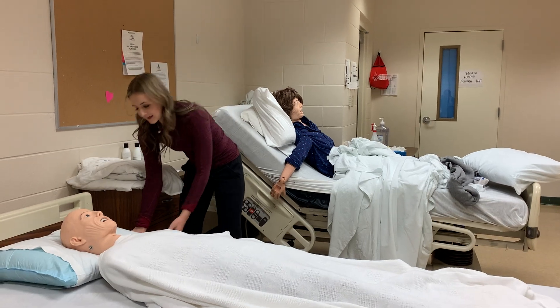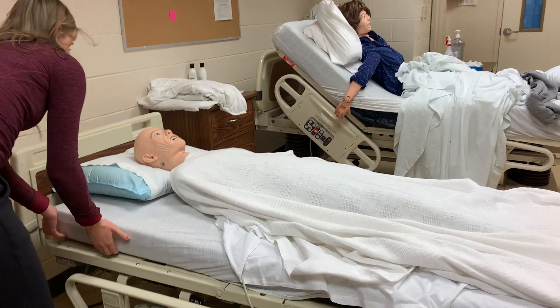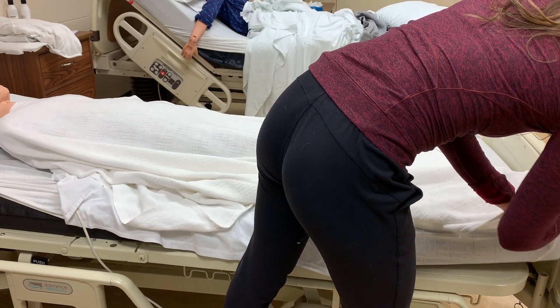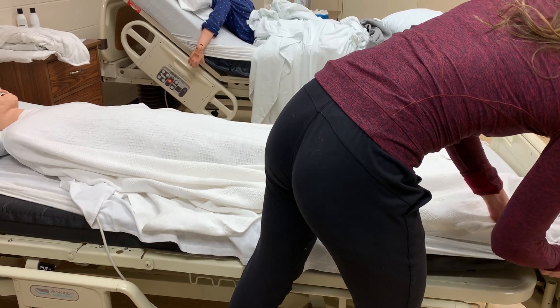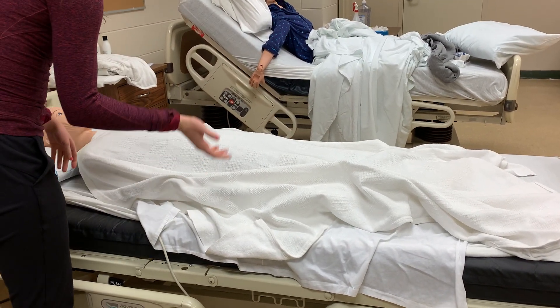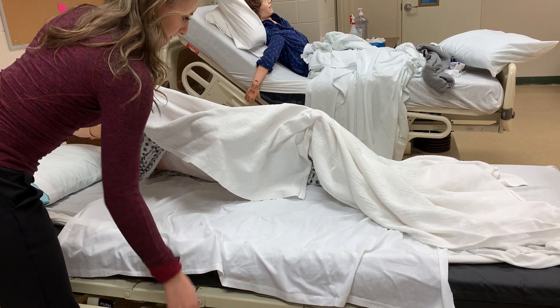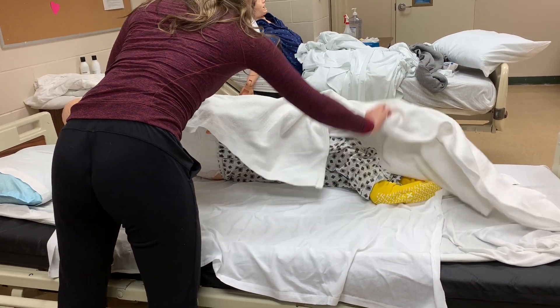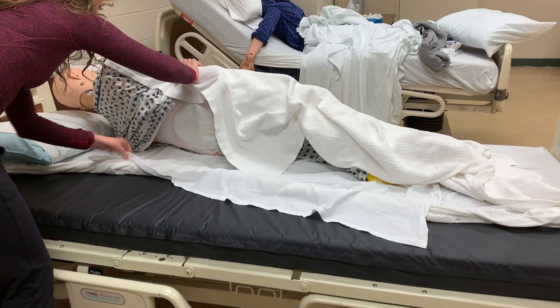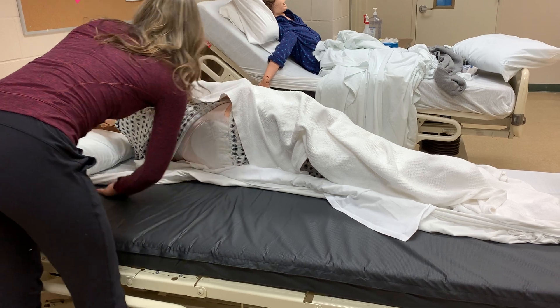Next, I'm going to loosen the corners of the bed sheet on the side I'm working on. Then I would have my patient assist me if they're able to roll to the other side. And then I'm going to roll these sheets in towards the patient.